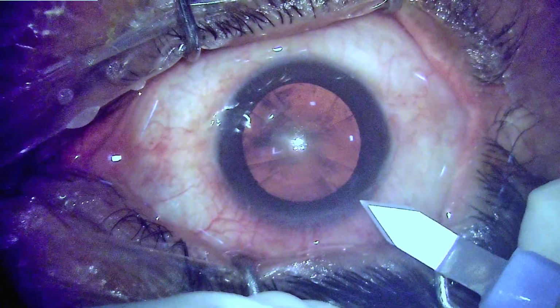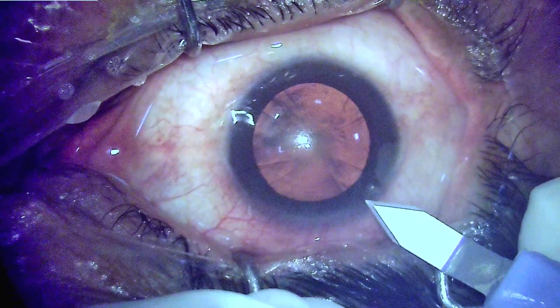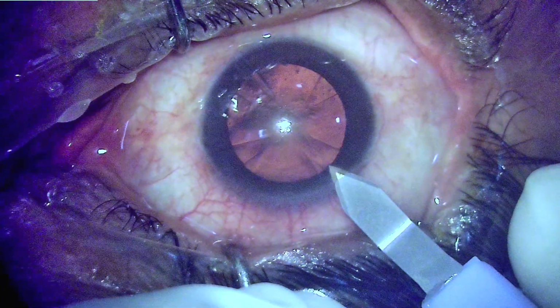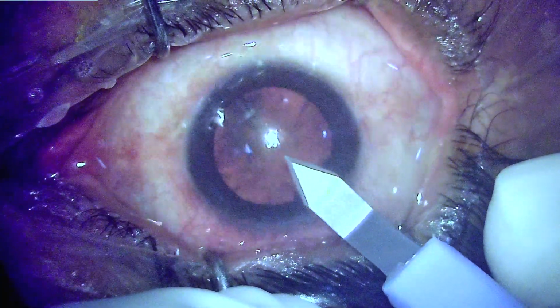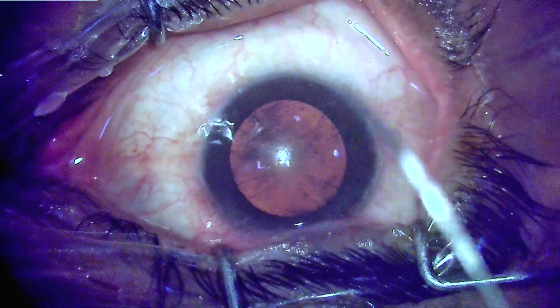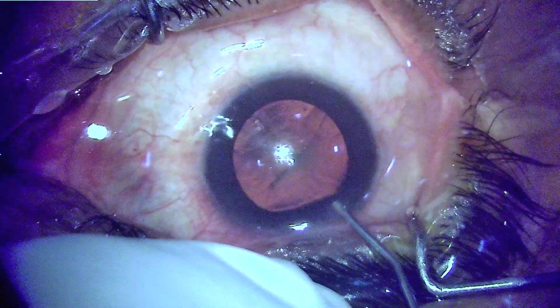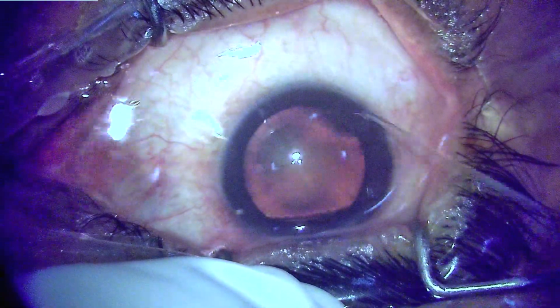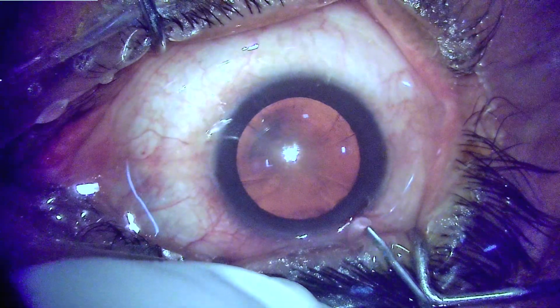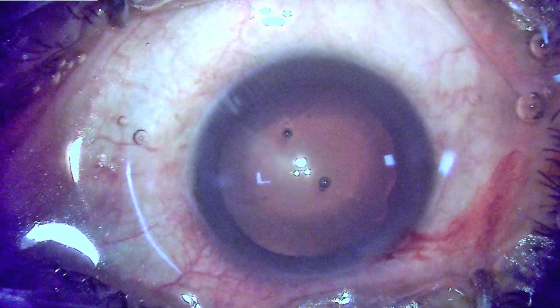Here is the point where we are starting the surgery, placing the corneal incision at the steep axis, and at this moment we can appreciate the radial keratotomy scars visible in the cornea in the mid periphery. Making the incision, and this being a nuclear cataract, grade 3, should not be a difficult task. Instilling intracameral lignocaine. This video is not about performing cataract surgery but having accurate biometry and IOL power calculation and post-operative predictable refractive errors.